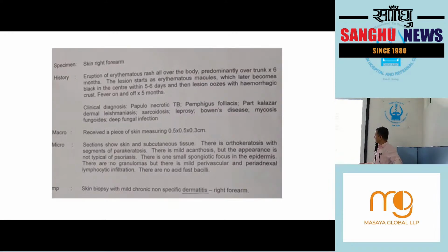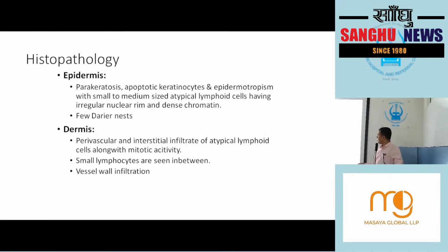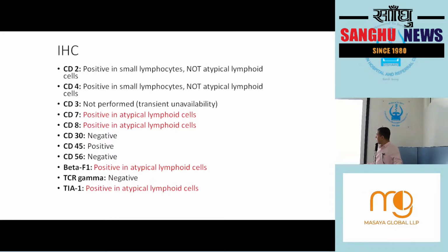A skin biopsy was done and reported as non-specific dermatitis. And this is the report I received from Professor Kemp. According to him, there was some parakeratosis, epidermotropism, and some CD7 positive, CD8 positive, CD4 negative cells in this case. TIA1 positive, cytotoxic, and beta F1 positive.